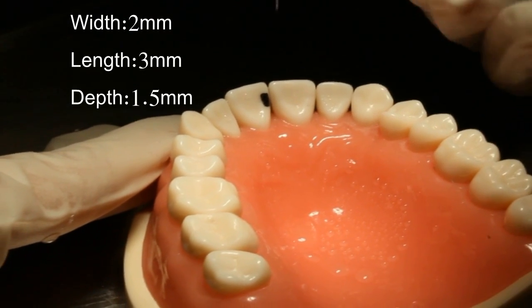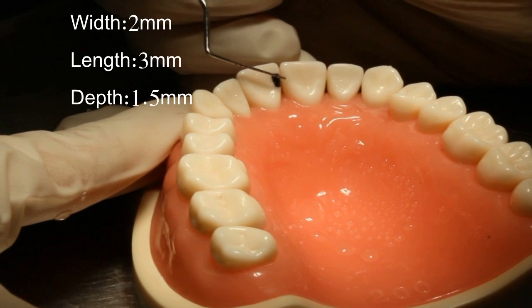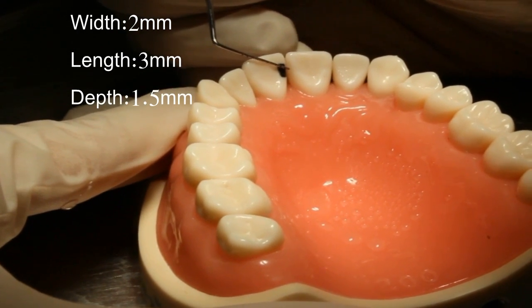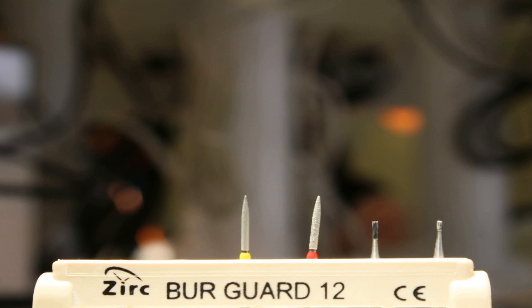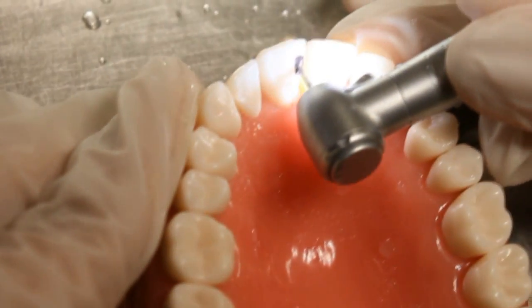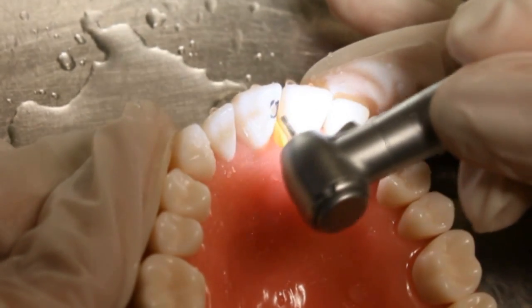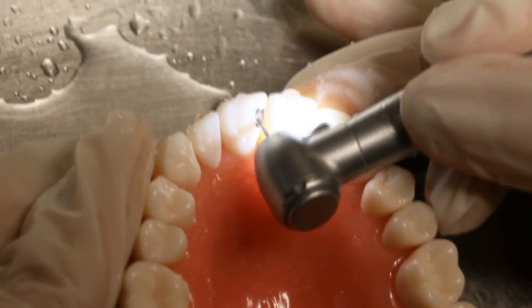We start with drawing a simple class 3 cavity — the measurement is length 3 mm, width 2 mm, and depth 1.5 mm. The bur used is bur 330. We start drilling following the outline, as simple as any preparation.